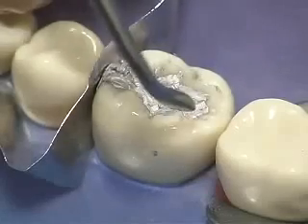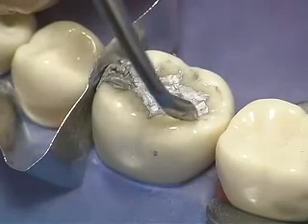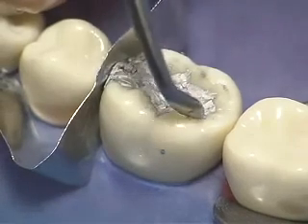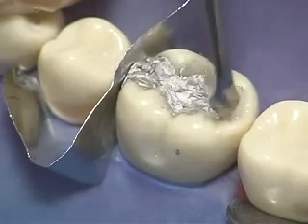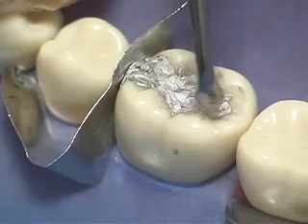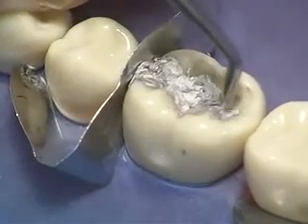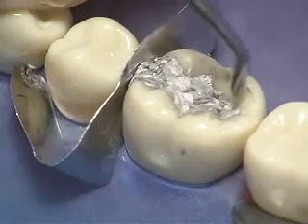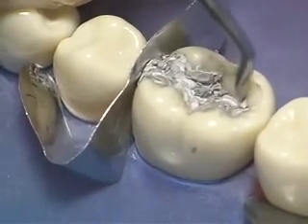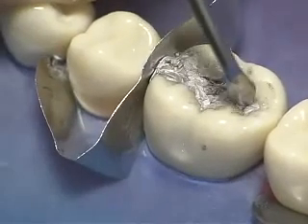Occlusal carving is started when the amalgam shows some resistance to the carving instrument. Use an explorer, discoid, or cleoid to test the amalgam for resistance. Angle the cleoid so that the tip rests in the area where the secondary groove will be and the side rests against the remaining tooth structure of the cusp. The instrument is inclined so that the existing tooth structure can help shape the amalgam, thus restoring the natural occlusal anatomy.